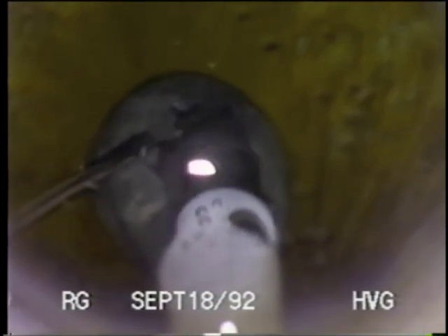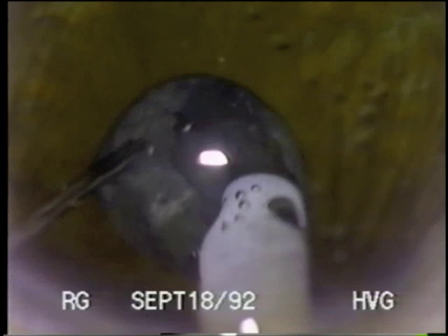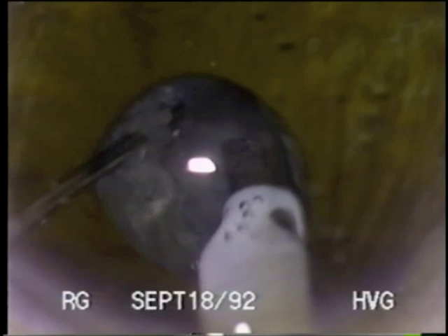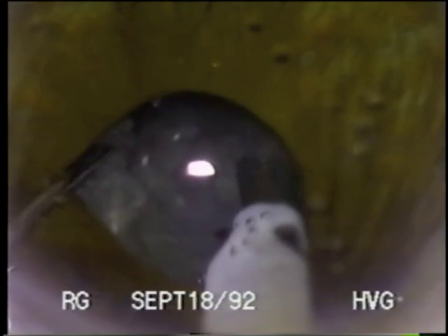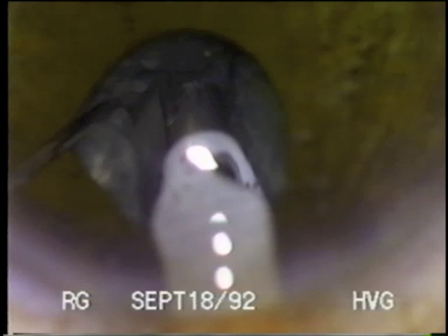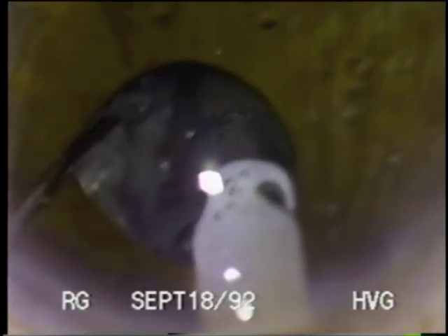This is particularly appropriate if the nucleus is quite hard. With the nucleus nudged inferiorly, the phaco tip sculpts a trench or trough or debulks the superior portion of the lens. Once this area has been sufficiently debulked, the instrument tips are placed deep in the lens and using direct action fracturing — the spatula pushing to the left, the phaco tip pushing to the right — a fracture is made. Rotating the lens slightly clockwise allows the tip to embed itself into the nuclear wall. Notice that the second fracture is made by taking advantage of the radial cleavage planes of the lens itself. No ultrasonic power is used to make this fracture. With the spatula stabilizing the left hemisection, the segment is emulsified in the center of the lens.